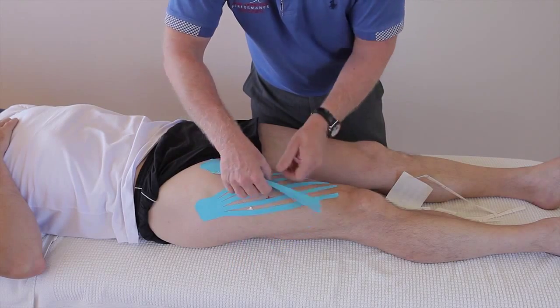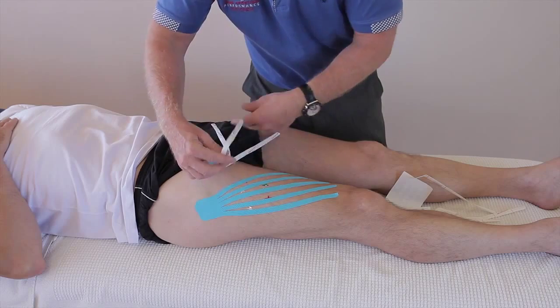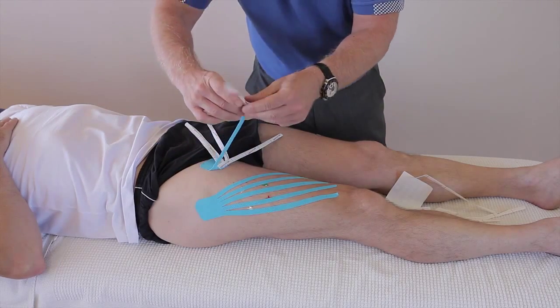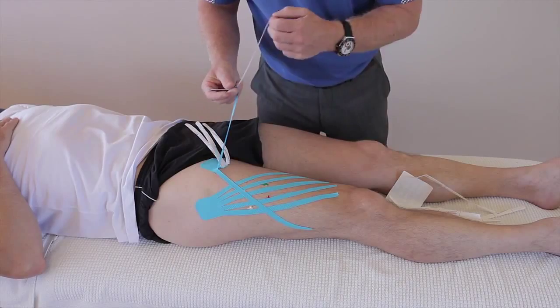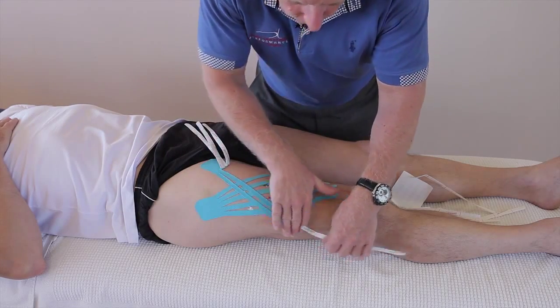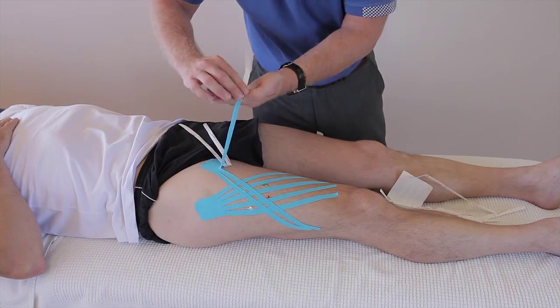Again, if I wanted to, I can move the 4 fingers out of the way. So we'll start on this one there. Peel that one back. And then literally just cross that area where it's all swollen. I'd definitely leave this on for 3 to 5 days, if not longer. Probably no longer than 5.